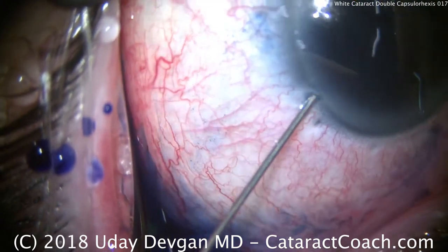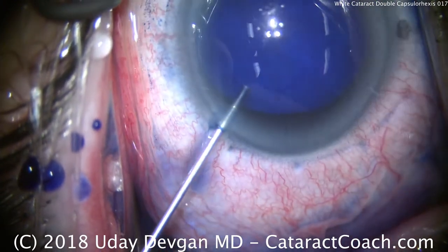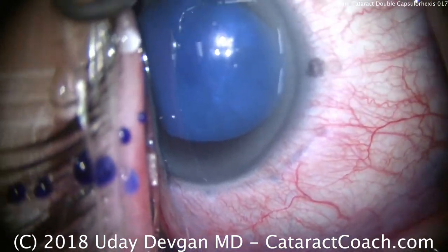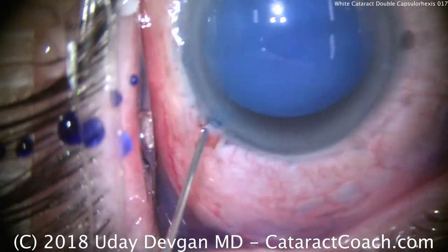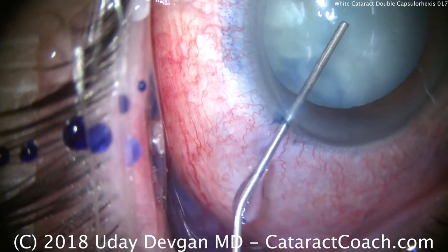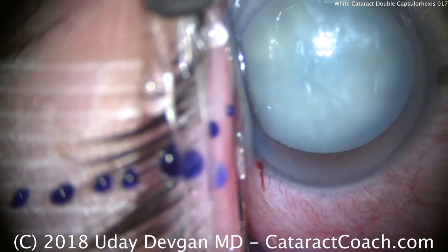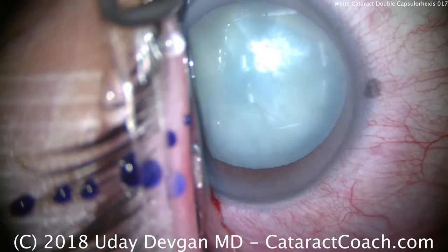Why do we want a double capsulorexis? Well, this is an intumescent white cataract, or fluid-filled. We want to do a small capsulorexis initially, then depressurize the capsular bag, and then do our normal-sized capsulorexis. There's the viscoelastic being instilled in the anterior chamber. I use a dispersive viscoelastic to maintain the AC, but also to protect the corneal endothelium.